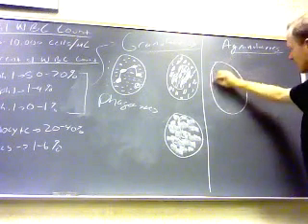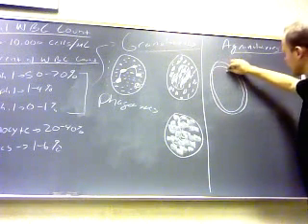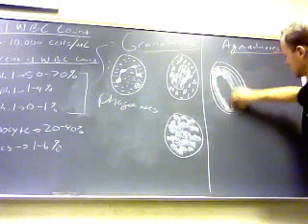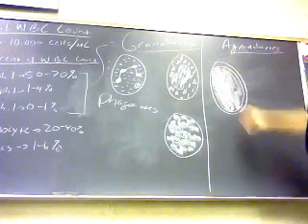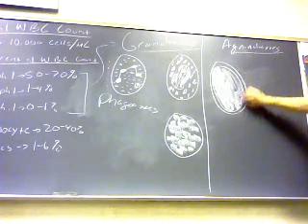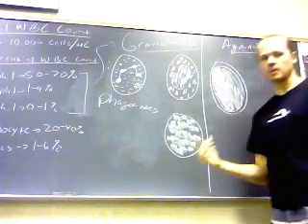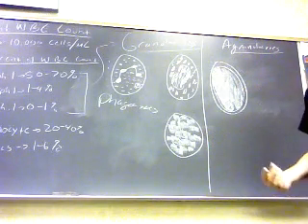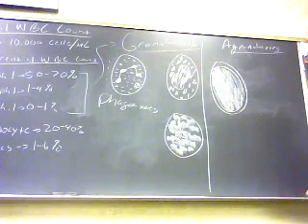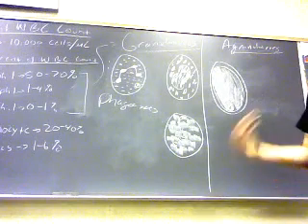Okay, lymphocytes. These are extremely easy to spot under a microscope because they have a very large nucleus. Their nucleus takes up almost the entire cytoplasm of the cell. It's so big. Now that should tell you something, because you remember the function of DNA. The major role of it is it's a code to make proteins. It helps regulate the cell cycle, how cells divide and all that stuff.